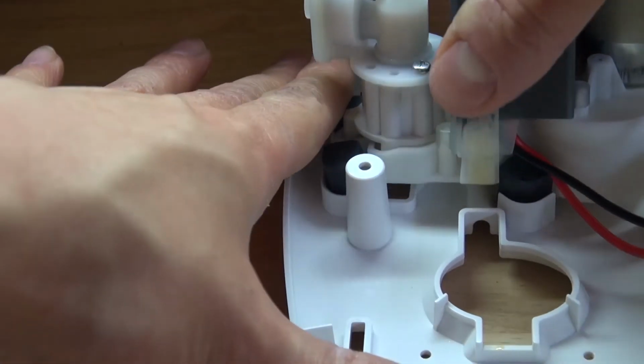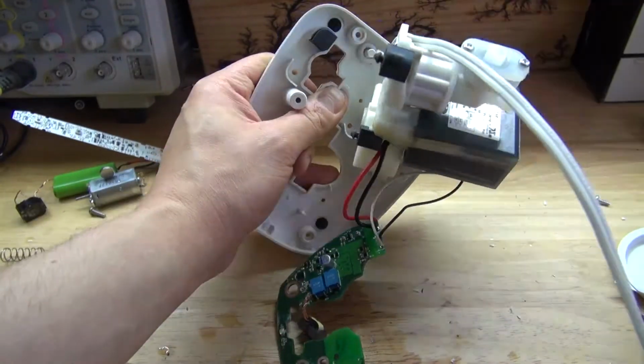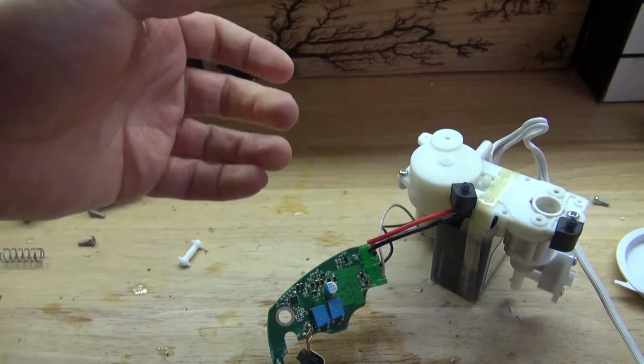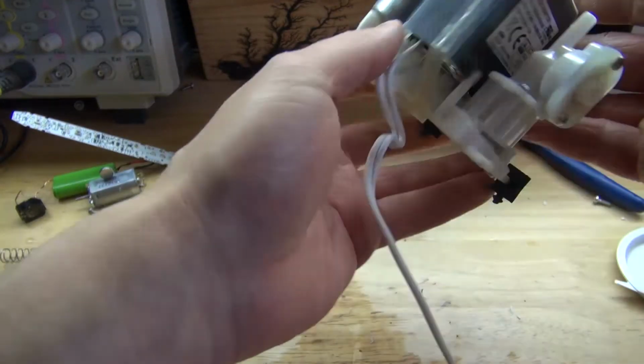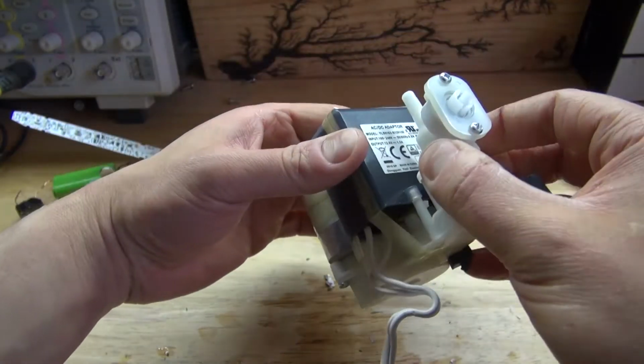Now let's go a little deeper, and this right here is a water pump. Carefully remove it, and carefully remove the wire. And now the bottom housing is removed. As you can see, it's just a basic water pump. I can probably use this to make a water fountain, possibly.